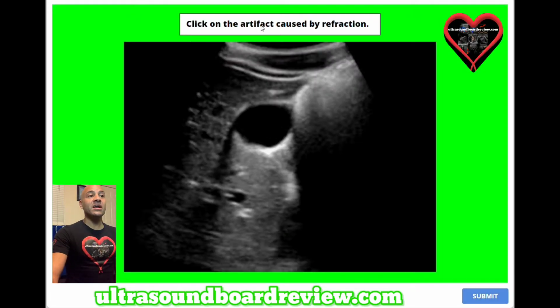Question number 10. Click on the artifact caused by refraction. The answer is right in this region here.